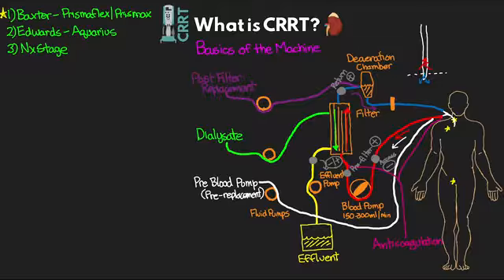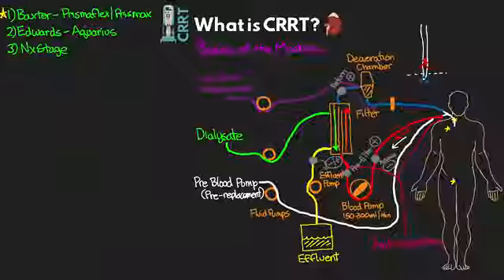So hopefully this lesson gave you a good understanding of what exactly CRRT is, the indications and why we're using it, and gave you a good overview of how this circuit is set up, so that as we talk through some of these next steps, you'll have an understanding of where this stuff is taking place.